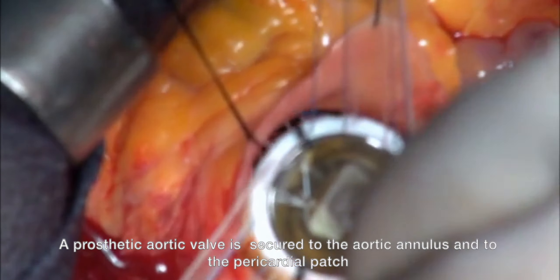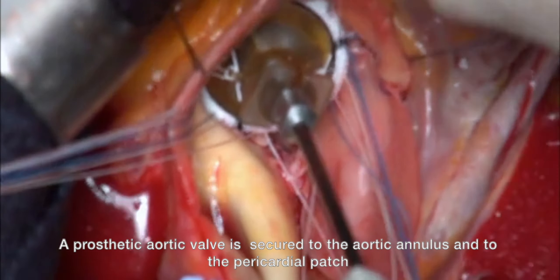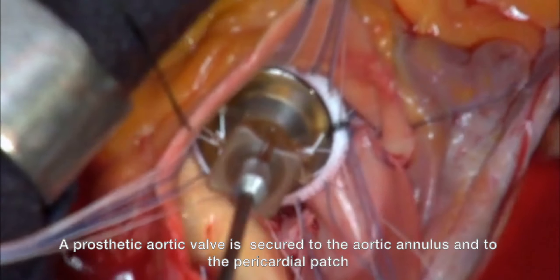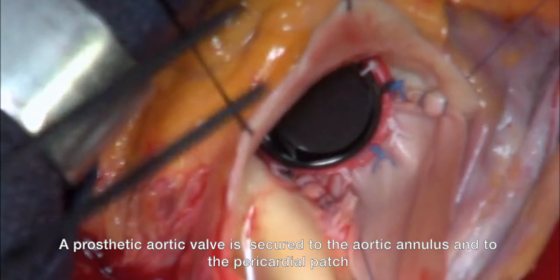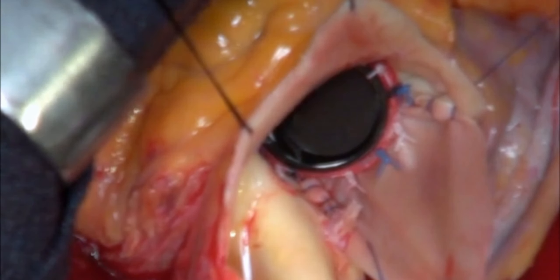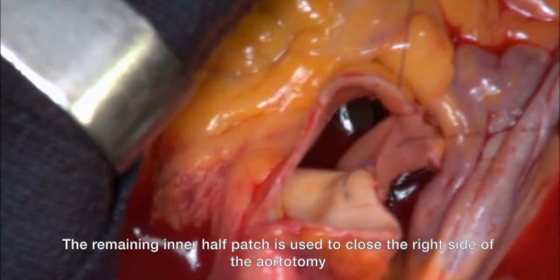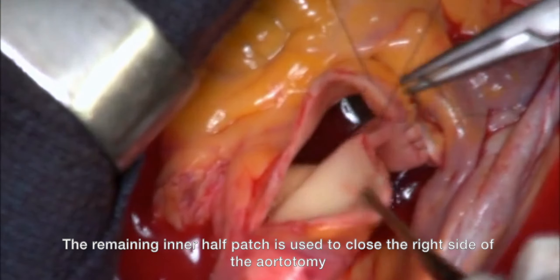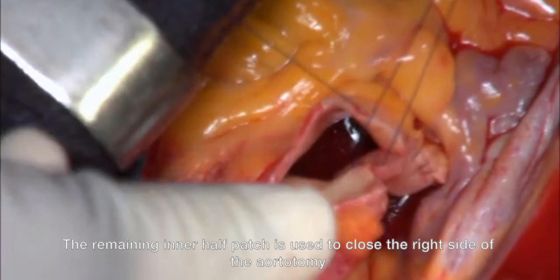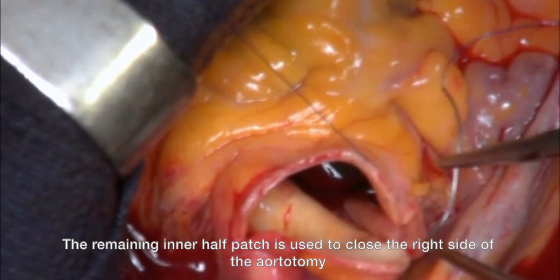The prosthetic aortic valve is secured to the aortic annulus and to the pericardial patch. During the aortic valve replacement, the stitches in the pericardial patch can be passed from the aortic sewing ring to the other side of the pericardial patch. The remaining inner pericardial patch is used to close the right side of the aortotomy.